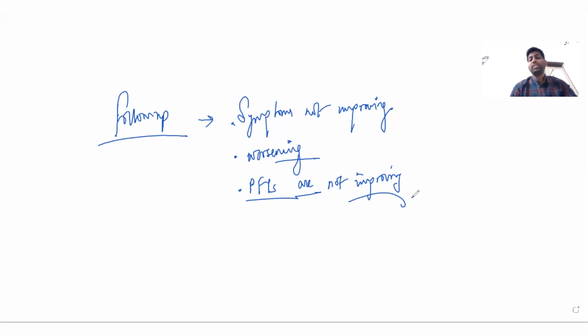There are very few indications of a CT scan, and there are a lot of situations when it is done but is not necessary. So these are the recommendations. There are two: the first is the AIIMS protocol, and the second is the Society of Chest Imaging and Intervention. These are the two main protocols that are followed, and these were the broad indications of CT scan in COVID-19.